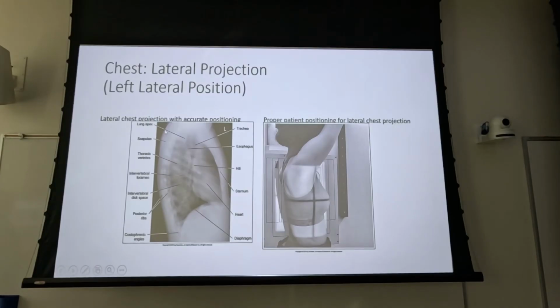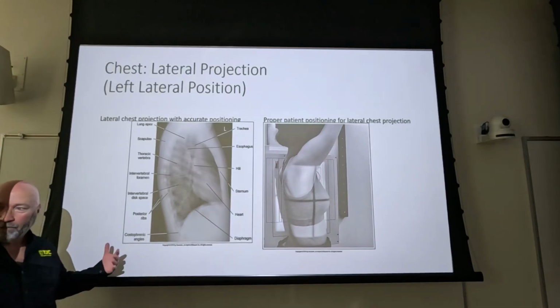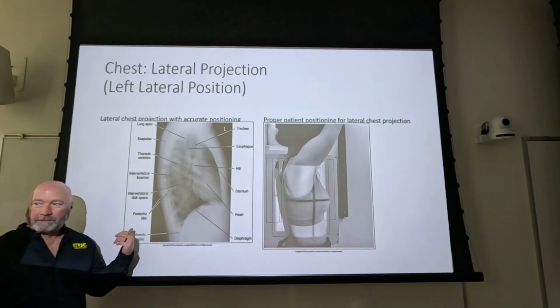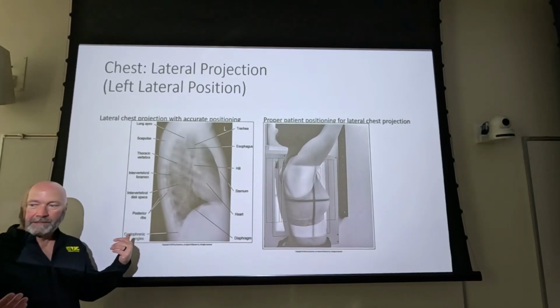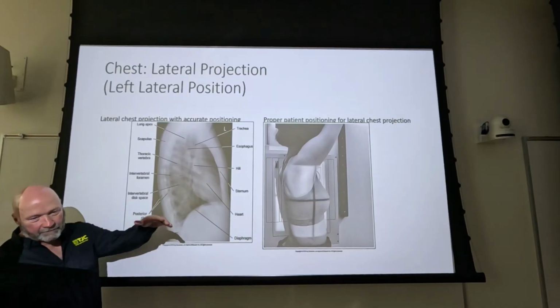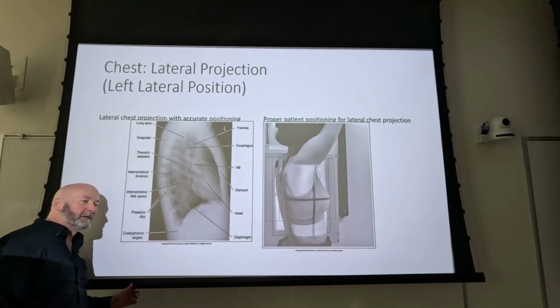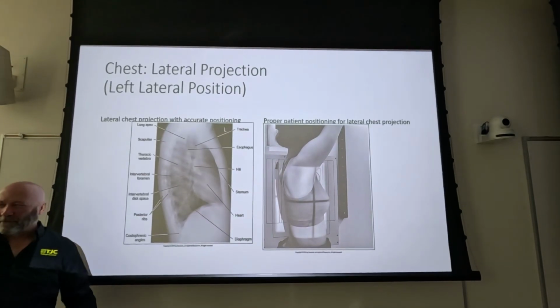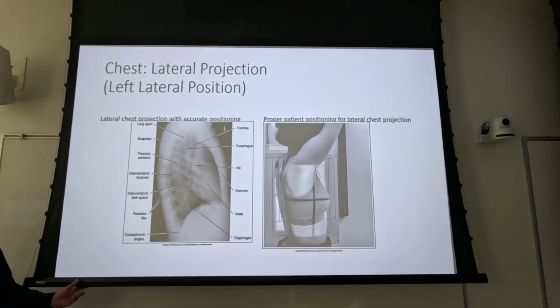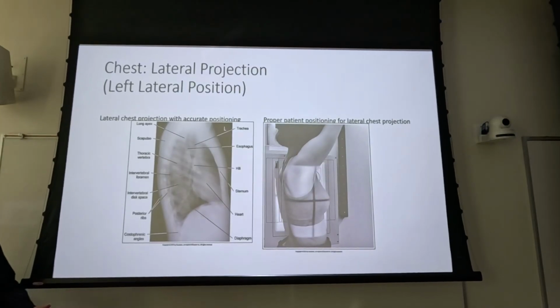So make sure that you get them in as good a lateral as possible. What I recommend is to tell them, point your feet directly at that wall. Now I want you to touch this thing. Don't tell them to put their side up against it, because they will. If they've got broad hips or broad shoulders, they're going to have a tendency to lean into it. So I recommend you stay away from that description. I just want you to get up against this thing, right?